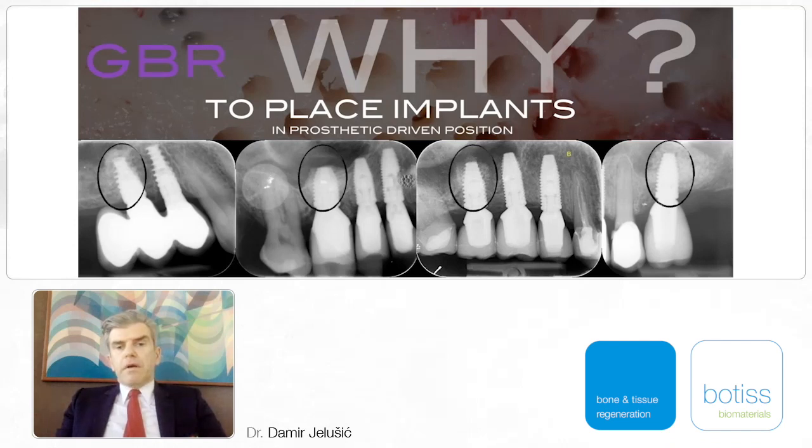You can see here a lot of implants in a maxilla, where some of them are done with a sinus lift, with the classical lateral window approach. Some of them are placed with Summers' technique, the osteotome technique, which is very simple, safe, and less traumatic for the patient.